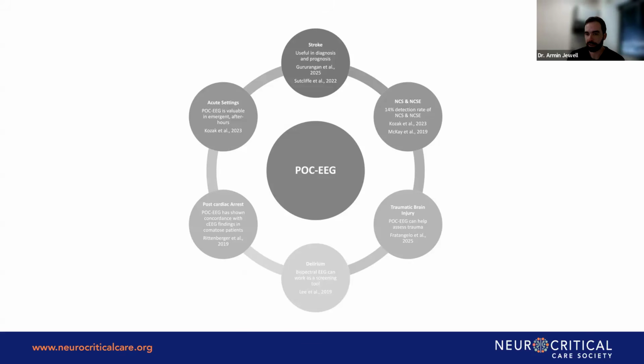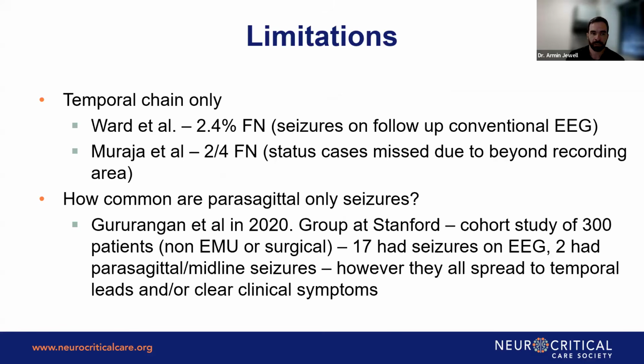So while point of care EEG has some utility, of course, that we're seeing, what are the limitations? Not everything has everything perfect for it. So we need to go through what the downsides of point of care EEG are. As we talked about before, some of the technologies are a temporal chain only.